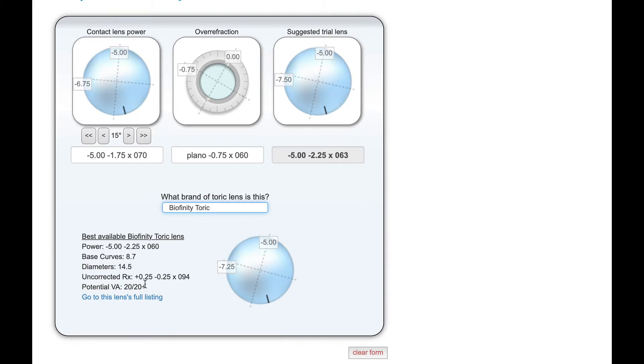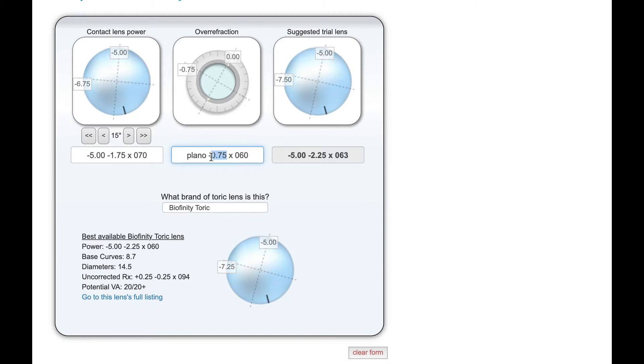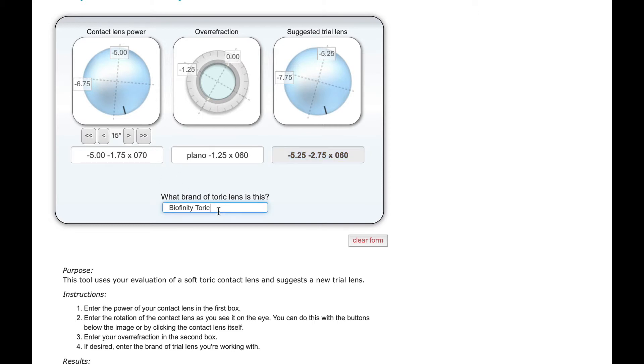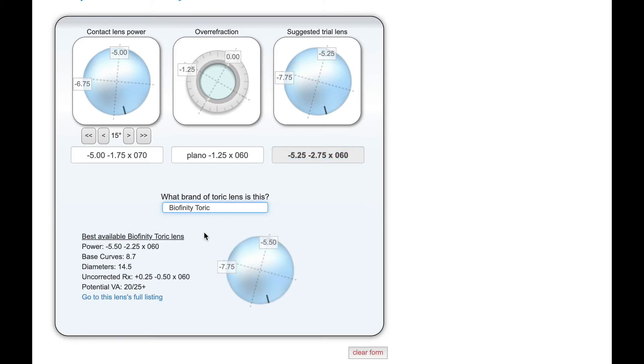And because of that, it says that the potential vision for this lens is very good. Of course, we all know that there's a lot of variables when it comes into this, but mathematically, this lens should be a good option. This suggestion feature is really helpful for when we start pushing the limits. So let's say instead of 0.75, let's say we over-refracted a buck and a quarter of cyl. And if we do our calculation here and go with this bioaffinity toric lens again.